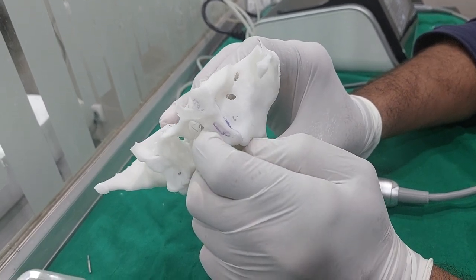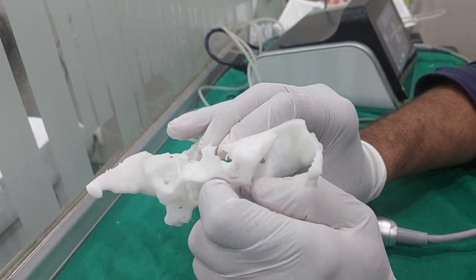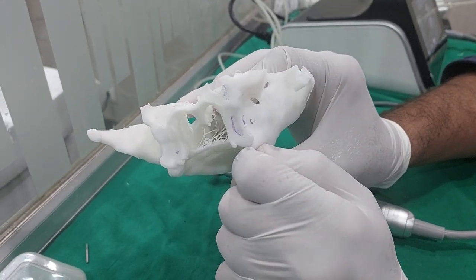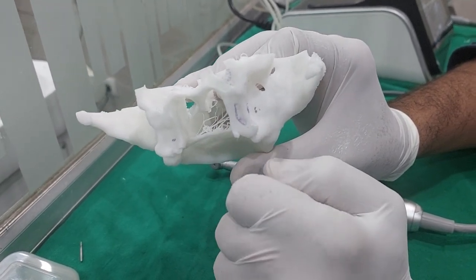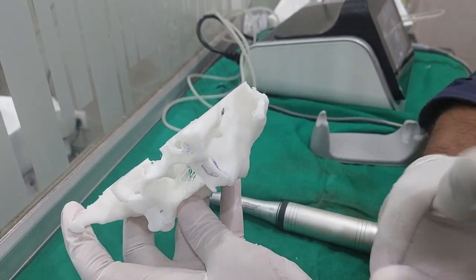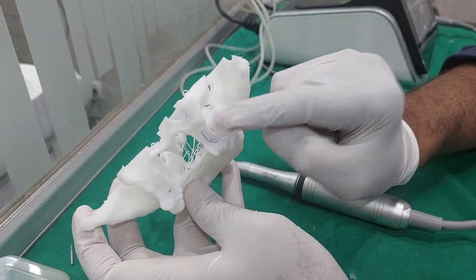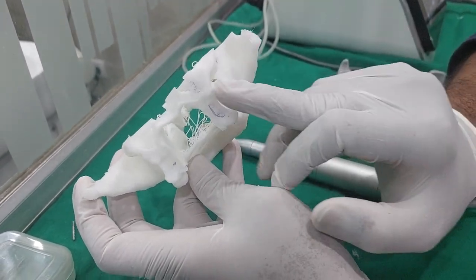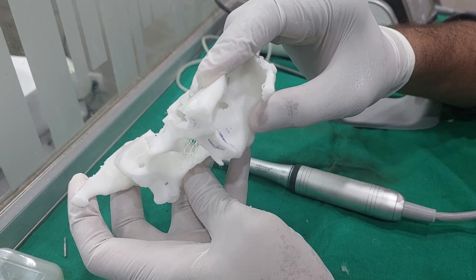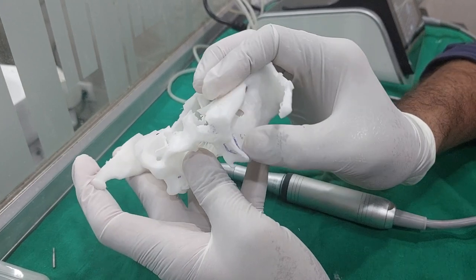So sometimes if we put an implant obliquely through the tuberosity and it is not anchored to the pterygoid, it is called a tuberosity implant or tubero-pterygoid implant. Every tuberosity implant is not necessarily a pterygoid implant. A true pterygoid implant is anchored to the cortical bone, which is made up of three fused bones: the pyramidal process of the maxillary tuberosity, pyramidal process of the palatine bone, and the sphenoid bone, which extends into lateral and medial pterygoid plates. In between these two plates there is space - the pterygoid fossa - and this fusion zone is 13 mm.